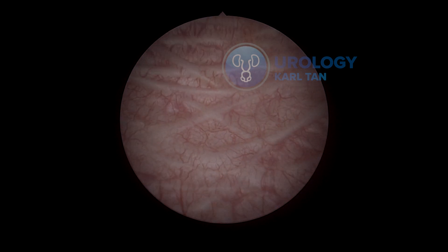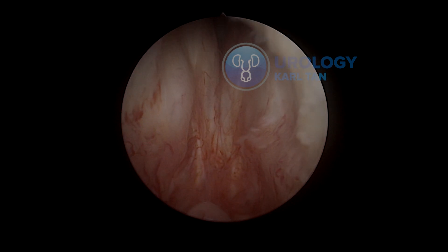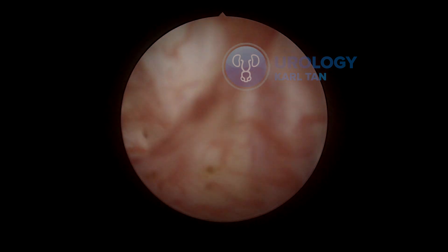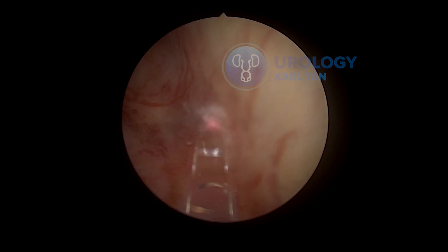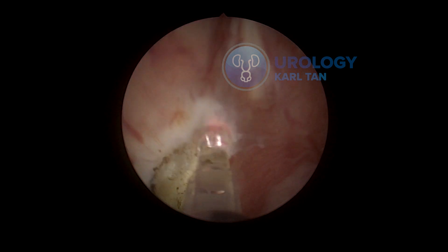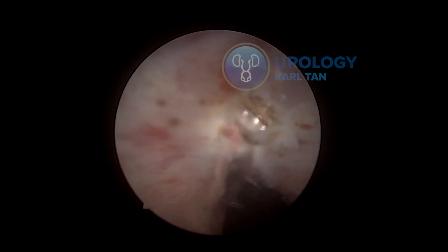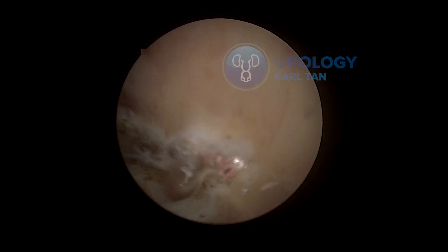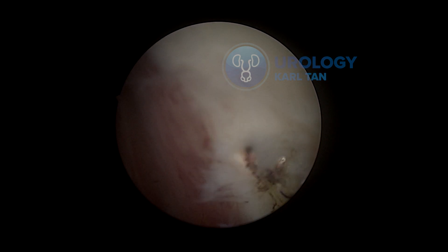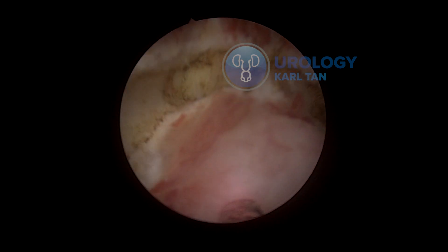Normally I would cut at 12 o'clock of the prostate. Make sure you put in your markers very well so you won't go into the sphincter. I start with an omega incision at least a millimeter above the verumontanum. This is the 12 o'clock incision marker, and then connecting the posterior marker to the anterior marker.